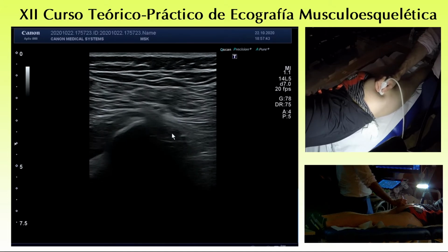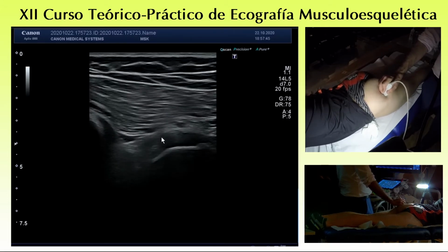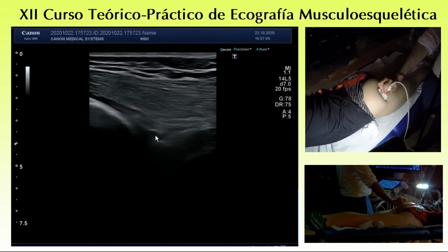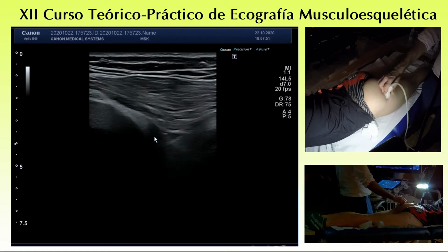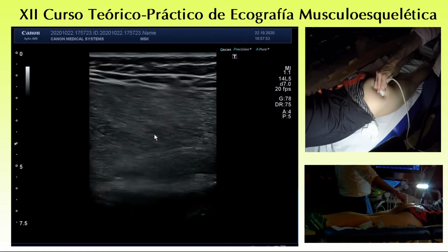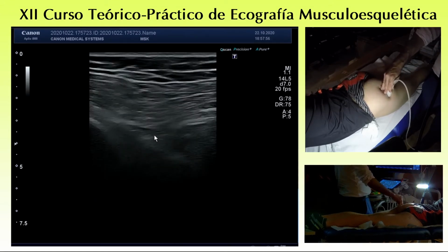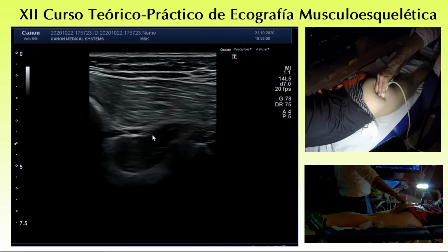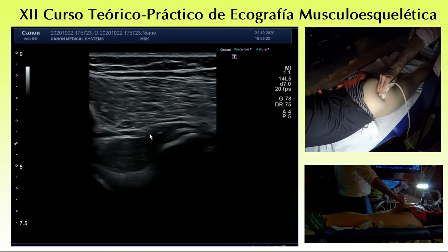Okay, and if you go down, we have the sciatic nerve here.